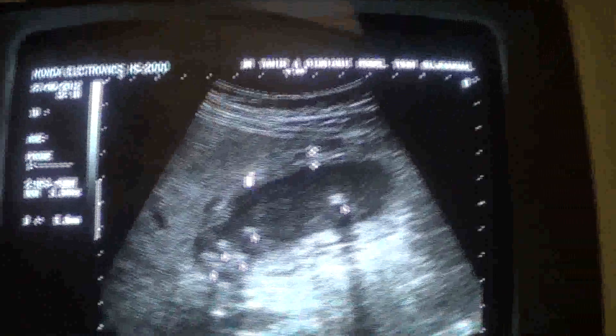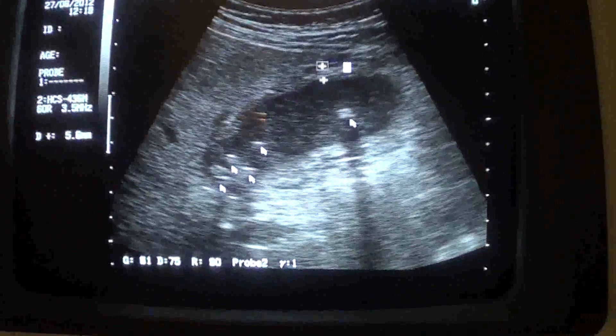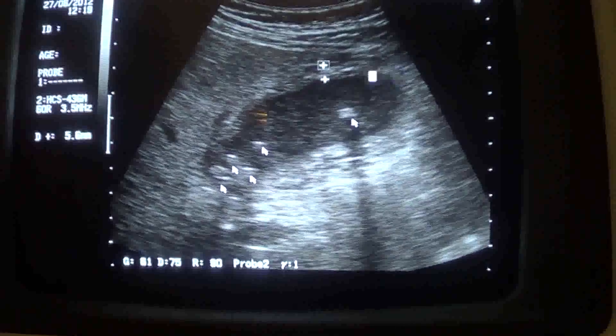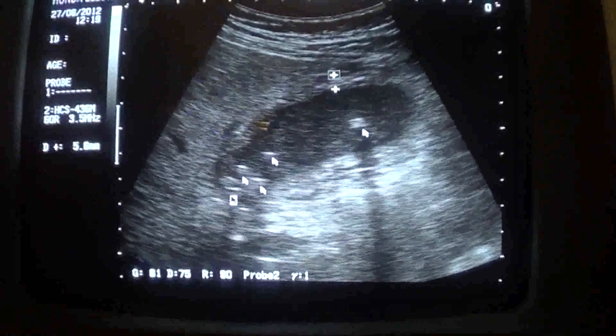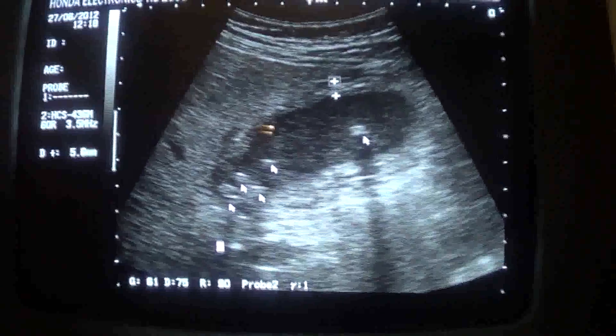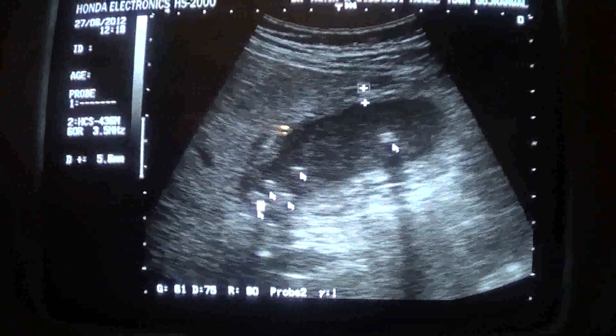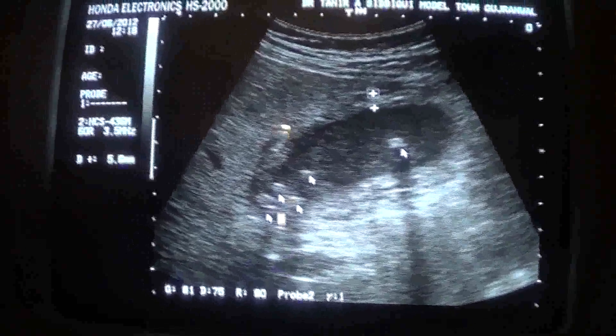This is the wall of the gallbladder, thick up to 5.6mm. This is the liver — normal. This is the portal vein, and these echogenicities are giving posterior shadowing.